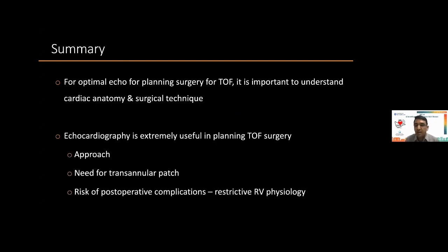So to summarize, for optimal echo for planning surgery for Tetralogy of Fallot, it is important to understand the basics of cardiac anatomy and surgical techniques, which we use contemporarily. Echocardiography is extremely useful in planning TOF surgery by deciding its approach, timing, need for transannular patch, and risk of post-operative complications such as restrictive RV physiology.